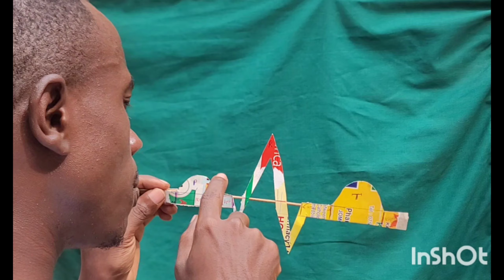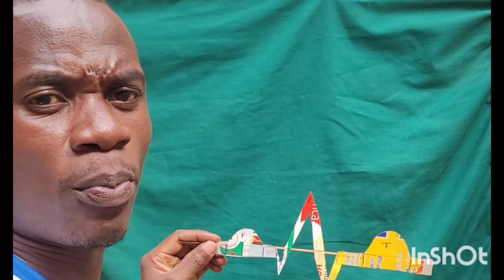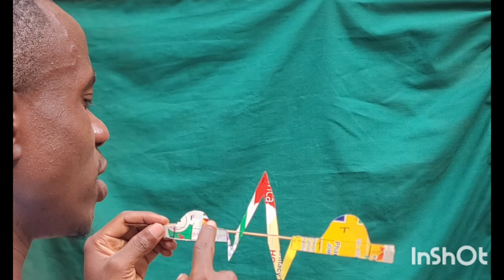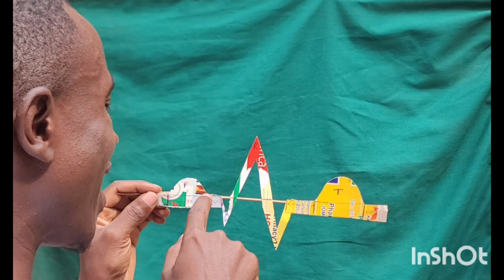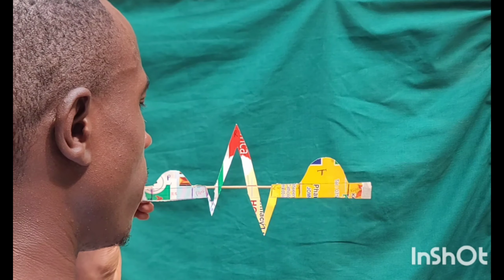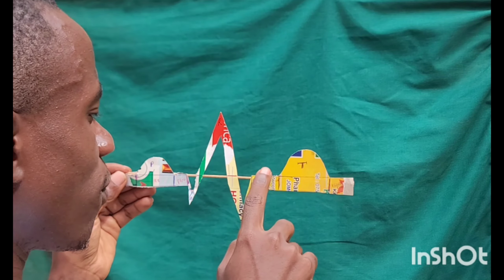And the reason for this PR segment is that this is the only time during which the action potentials are held within the AV node for about 0.1 second. Okay, because we said the AV node is a slow conductor. It can hold the action potentials for approximately 0.1 second. And it's during that time the ECG pointer comes back to the neutral, giving us this isoelectric line, which we call the PR segment. Such another beautiful thing.